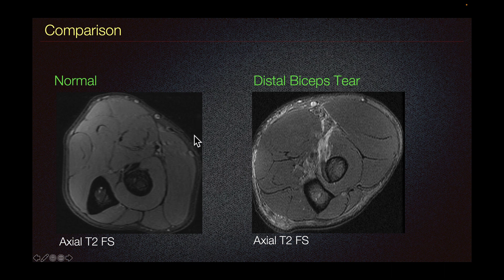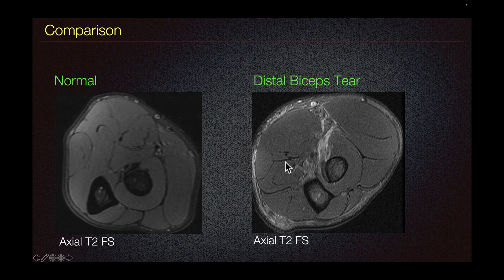This is a comparison showing a normal biceps tendon inserting at the radial tuberosity — we can see this hypointense band, which is normal. This is the case we just saw, showing edema signal without the hypointense band at the expected location of the radial tuberosity.